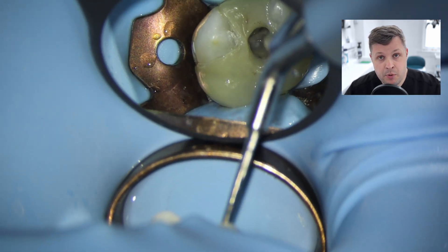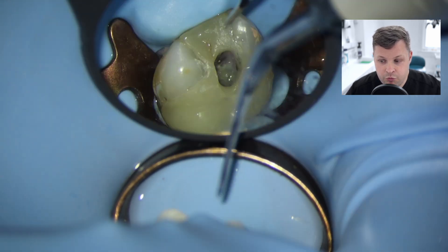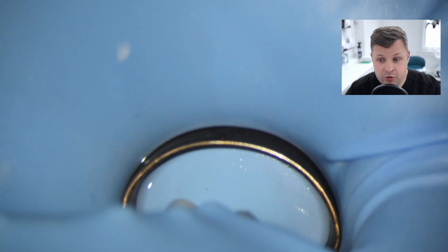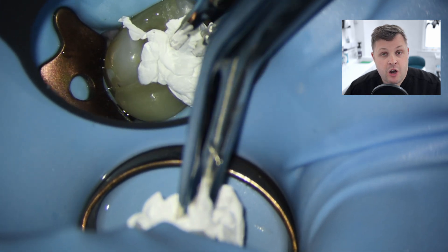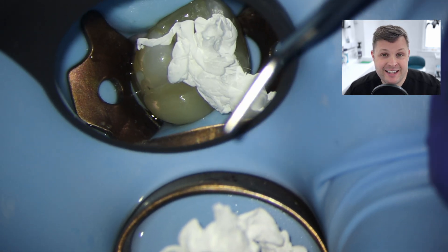I'm not convinced, and what I'm really worried about - and I have done before - is that I've been looking for an MB2 with my ultrasonics and I have caused a perforation, which is not what you want to do. To settle this once and for all, I need to take a CBCT image. In between, I'm just going to pack it with PTFE and a bit of GI.